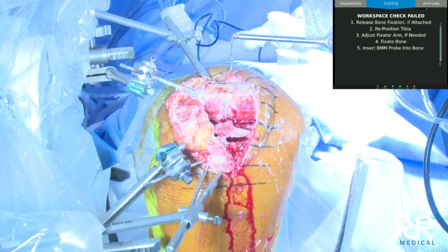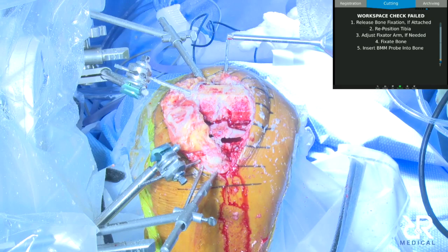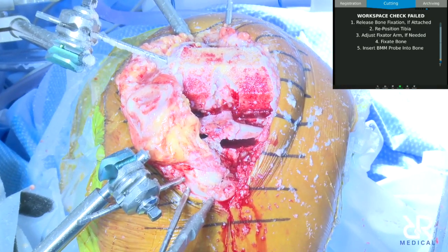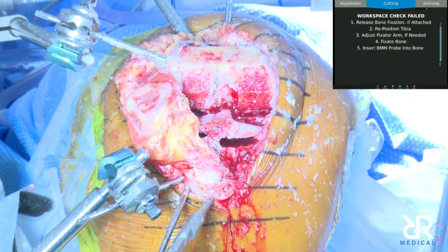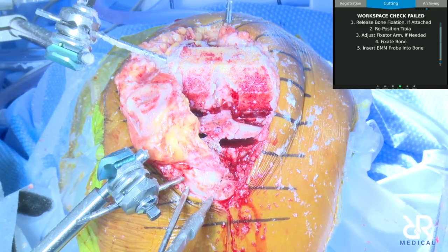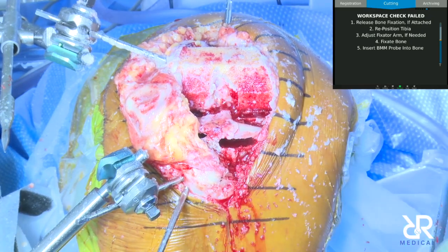Well, I think we're like 89% done with the tibia, so I'm just going to finish it with a saw. Let me have the T-handle. Hold this.